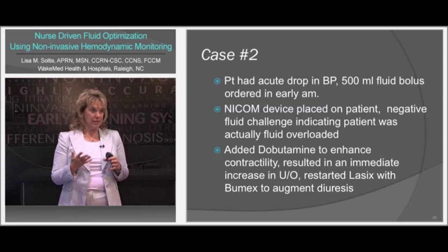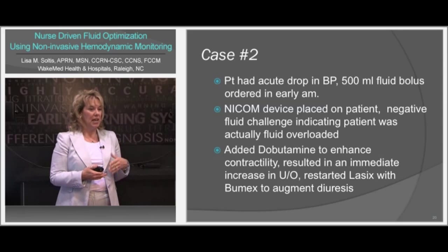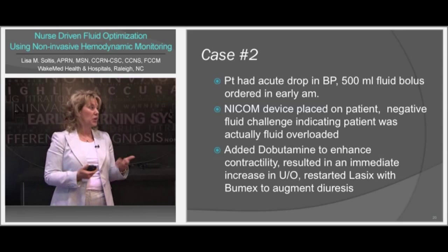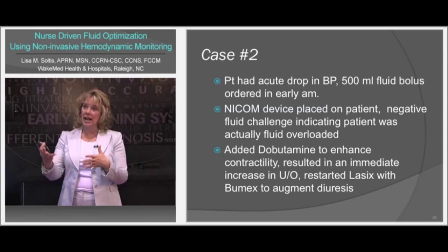During the night, prior to putting the NICOM on, they had DC'd all the Lasix for about 12 hours. About 6 a.m., his pressure continued to drop. The nurse called the doctor and said his pressure's dropping, and they said, well, maybe we dried him out too much, so give him a 500 ml bolus. So they gave him fluids, and then when I got there, around 7 or 8, to come see the patient, we put the NICOM on.